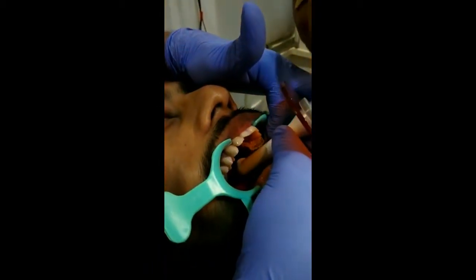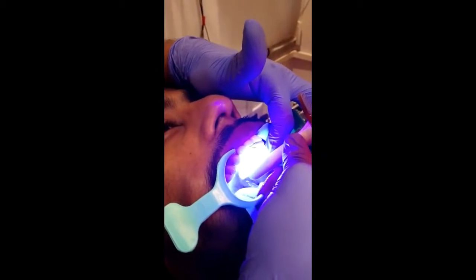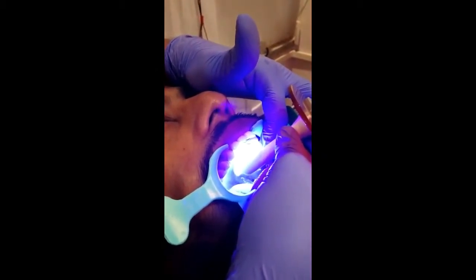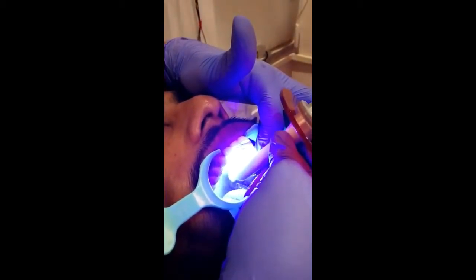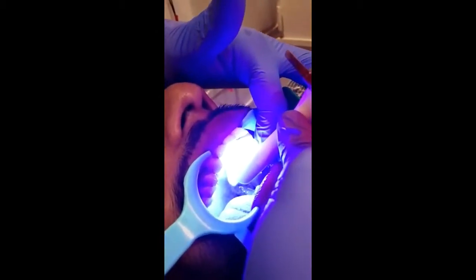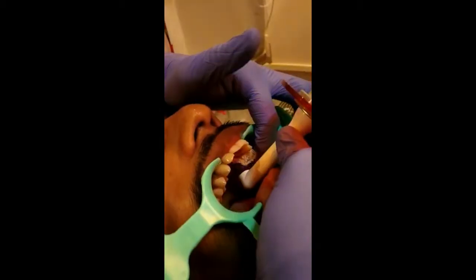What happens is the brackets in their final desired position on the teeth are incorporated into this tray. So we do not have to individually spend time on each bracket, placing them on the tooth surface and removing the composite and providing the final position intraorally in the clinical time. That time is taken up in the lab. So we are reducing chair side time, which is more comfortable for the patient and also for the operator.